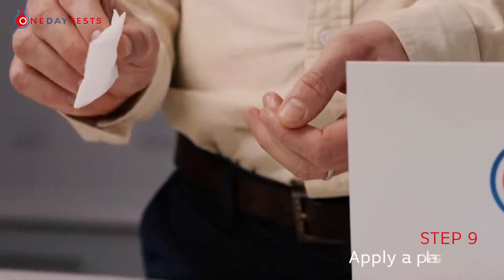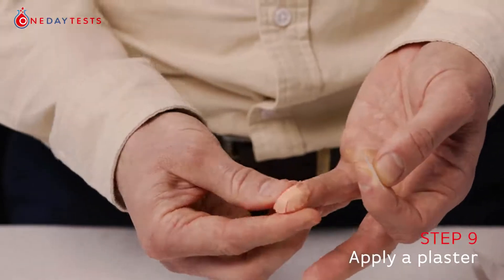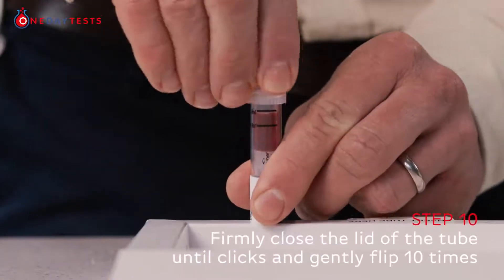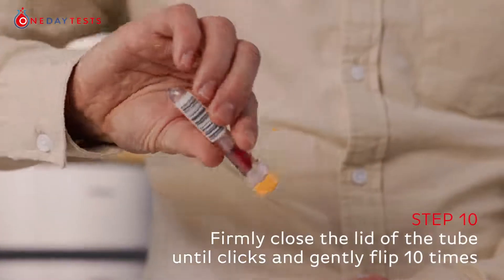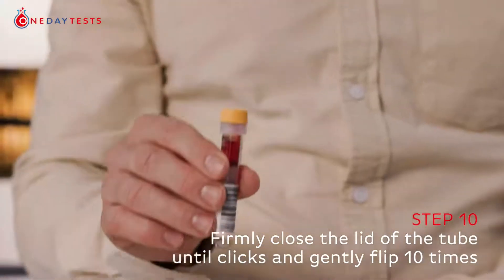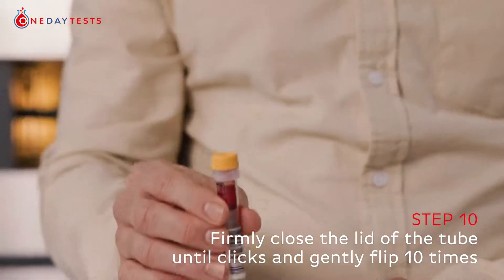Once the tube is filled, quickly attend to your wound — wipe it and apply a plaster. Put the coloured cap back on the tube firmly to make sure it clicks and seals. Once the tube is firmly closed, gently flip the tube up and down 10 times to allow the chemicals to mix with the sample. Do not shake the sample.